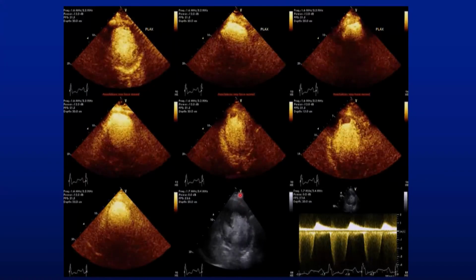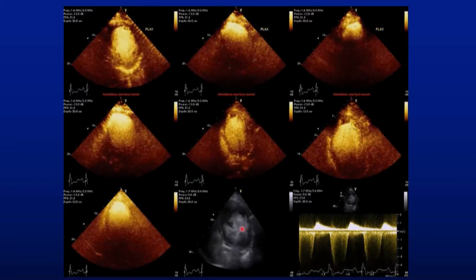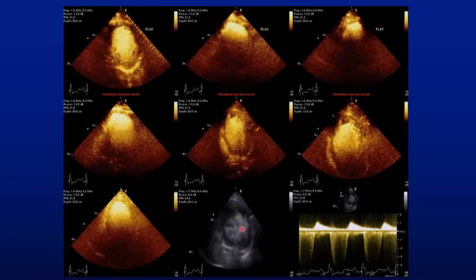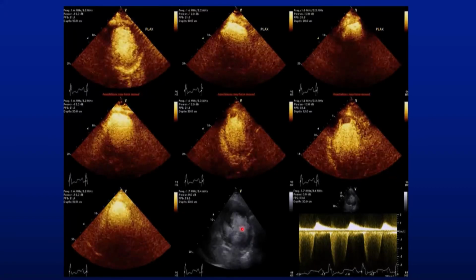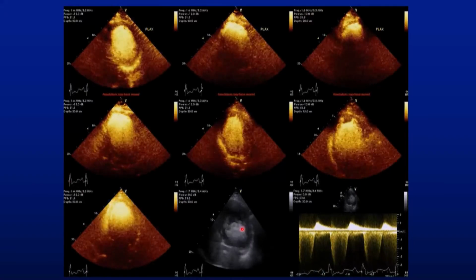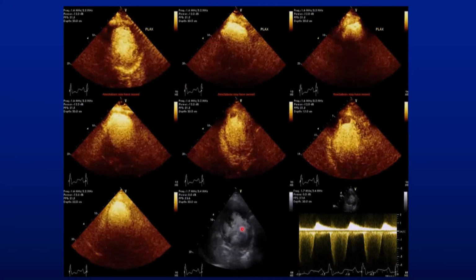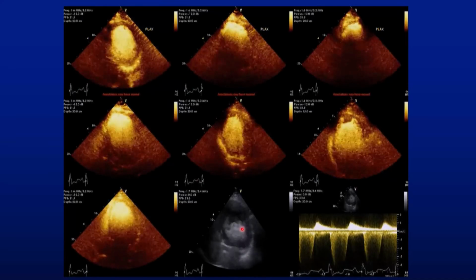So as you get close, you see this hurricane heart, and this hurricane heart is a mixture of contrast and destroyed contrast. Usually if it is contrastopenia, low contrast, you see low contrast everywhere. You understand? So they went from one extreme to another extreme. Got it?